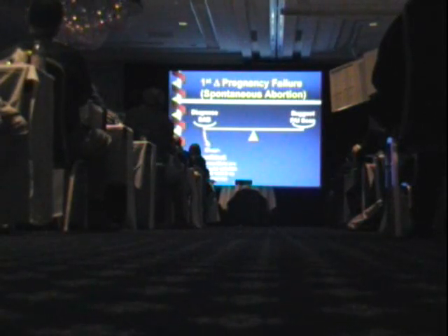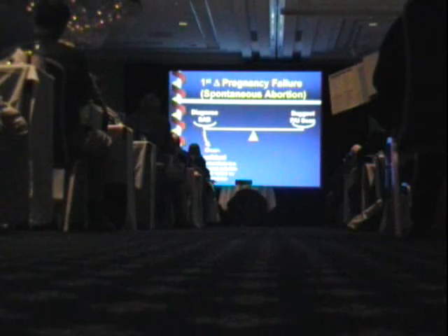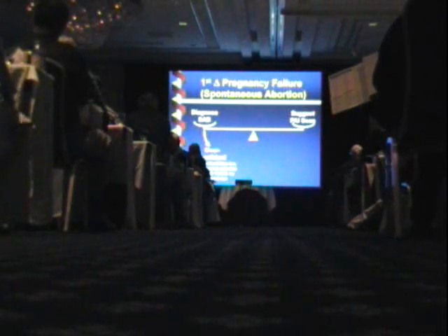What do I mean? Well, if you're overconfident, you're too radical in your diagnosis of early pregnancy failure, an example of that would be to diagnose pregnancy failure or spontaneous abortion when there's some chance of a good outcome. For example, if the beta HCG is 1500 and you don't see a gestational sac, you should be worried because you're supposed to by the time it's 1000.